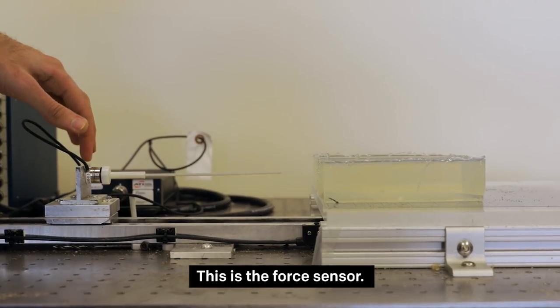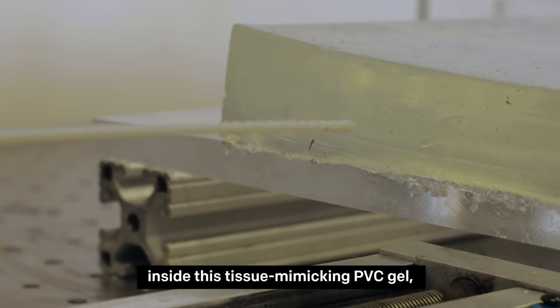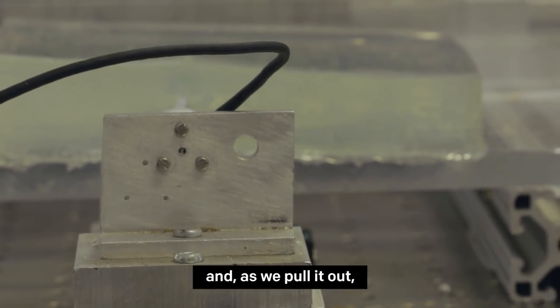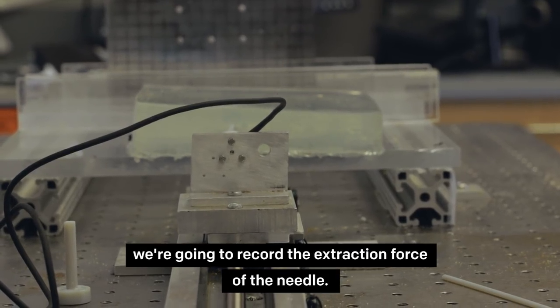This is the force sensor. As we insert our needle inside this tissue-mimicking PVC gel, we record the insertion force, and as we pull it out, we record the extraction force of the needle.